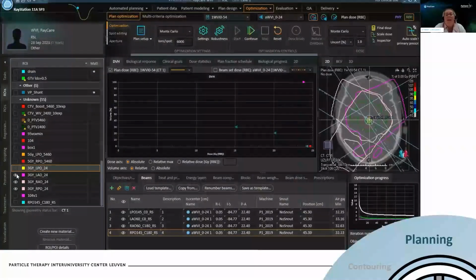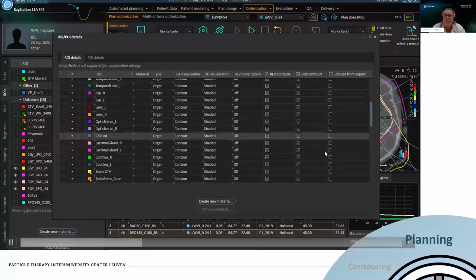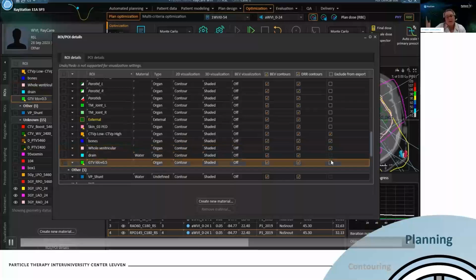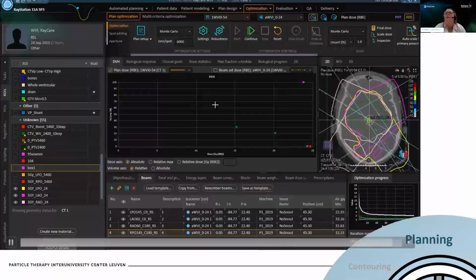Furthermore, within our plan tidying up steps, we create beam-specific low-dose ROIs, representing the beam path for each beam. So let me get that video started. So you see those beam-specific ROIs there. And we also exclude unnecessary ROIs, so unnecessary optimization or planning structures, from export. Keeping these unnecessary RT structures to a minimum helps us diminish plan transfer times from RayCare to RayStation, because that happens for every session. So that's keeping that transfer time to a minimum. So for me, it's a form of good housekeeping to do that, in my opinion. So it's basically just tick boxing the exclude from export button.